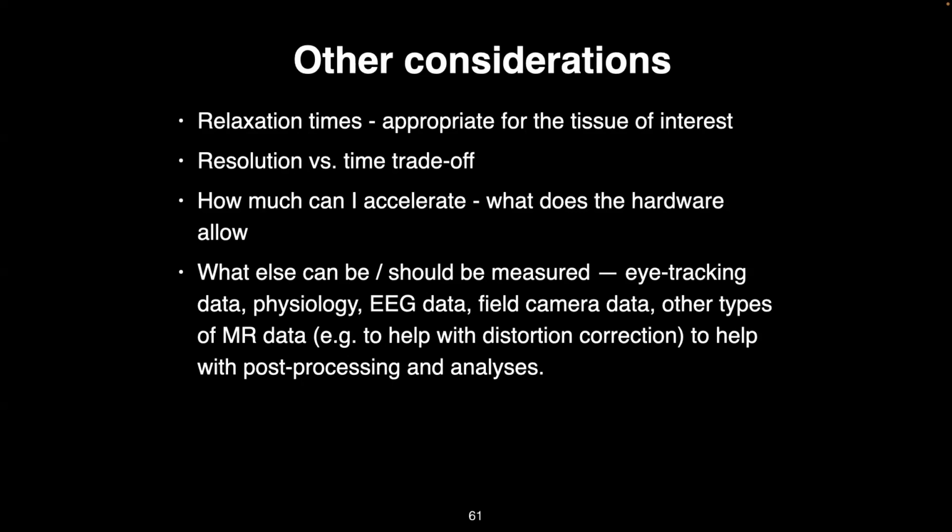When you accelerate, you're collecting less data, and that makes you more susceptible to noise. So if you have a very weak effect, that might not be the best choice for you, because your effect might get swamped in the noise generated by collecting less data. These are all things to think about and discuss with us as physicists, with the statisticians, and with folks that can help with designing your experiment.